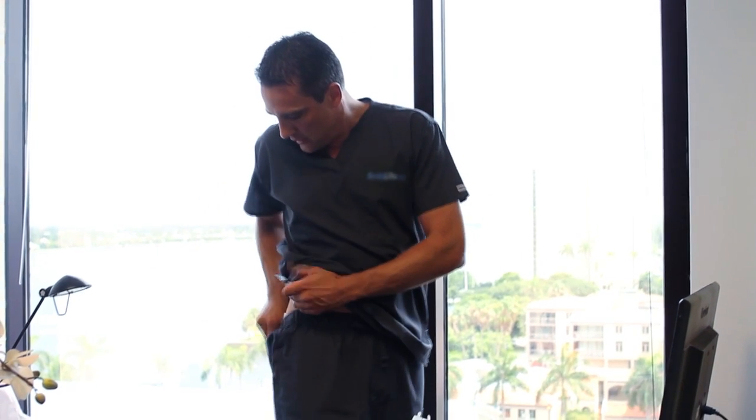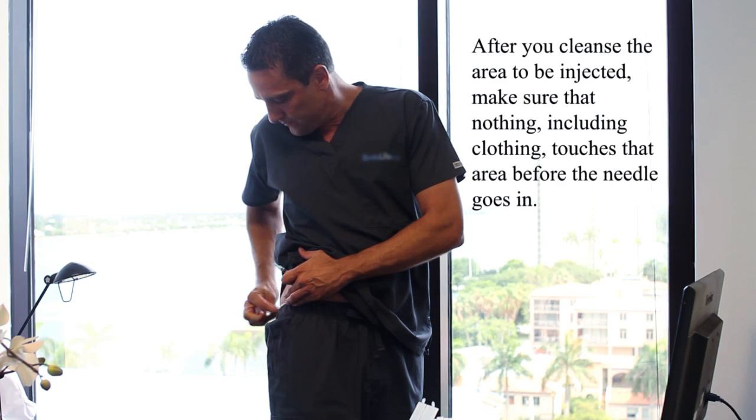The reason that I explain this in such detail is that down the center of the buttocks, there is something called the sciatic nerve. If you hit that nerve, it won't do any permanent damage, but it definitely won't feel good. It can cause a lot of excruciating pain. And it's very difficult to hit, so you don't have to worry as long as you follow these simple guidelines. So on that note, thinking of the upper outer quadrant, I'm going to go ahead and use my alcohol swab and clean off the proper area at the top.